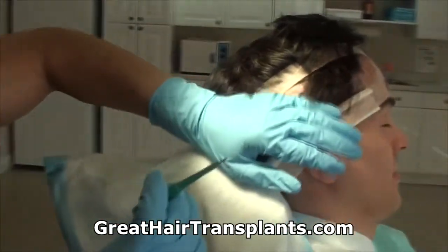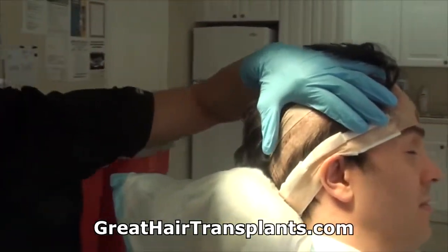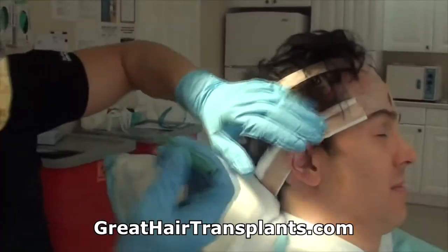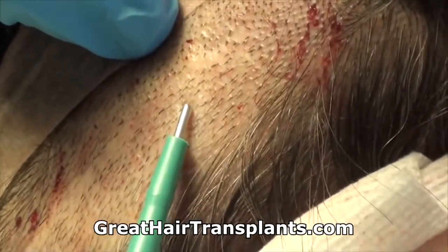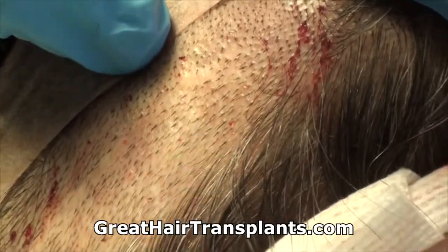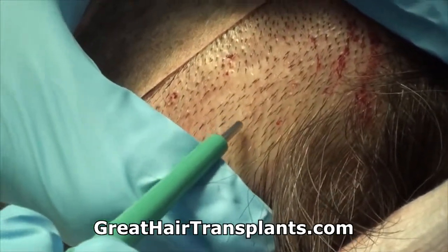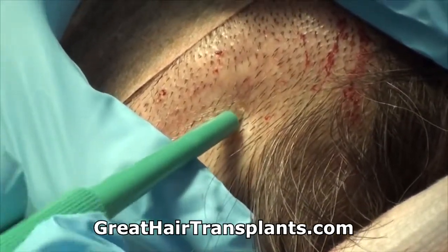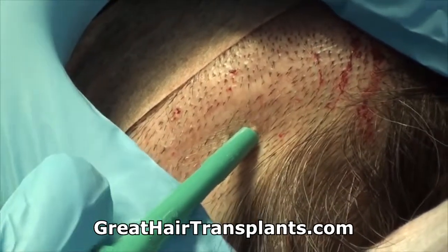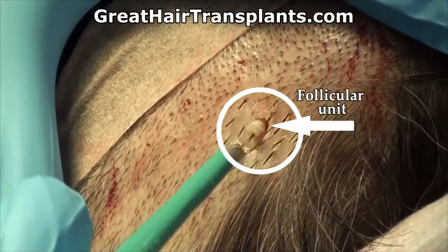When we're doing a follicular unit extraction, what we want to do is isolate the follicle, the follicular unit. The follicular unit comes out in little bundles. So this is a little bundle here, that's a little bundle there, and so forth. So what the doctor has to do is isolate that bundle. Okay, so let's pick a little bundle right here. And they're going to take that little bundle out with the follicular unit. Basically do a little punch. Okay, just like that. So the patient's obviously not feeling anything because he's all anesthetized. And we take that out.